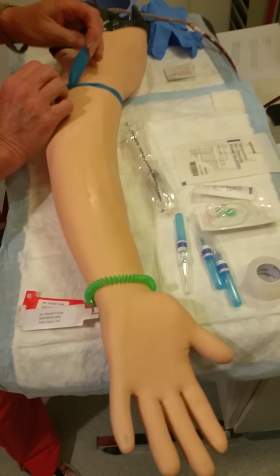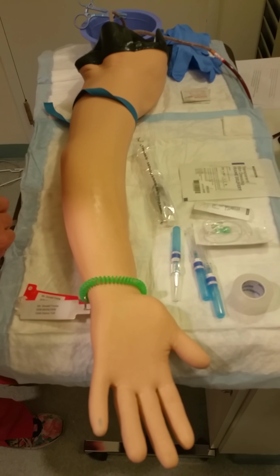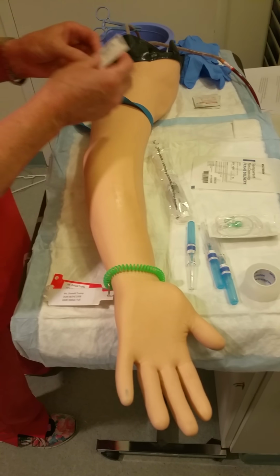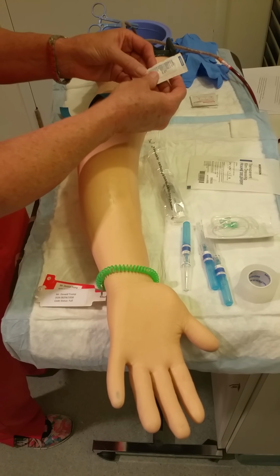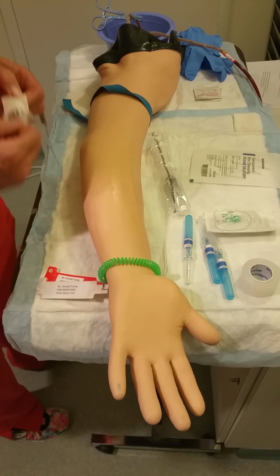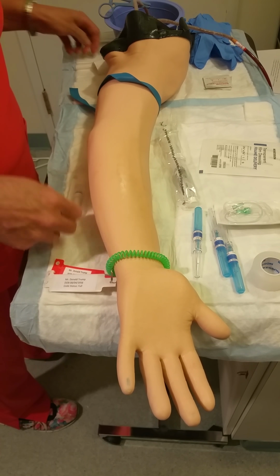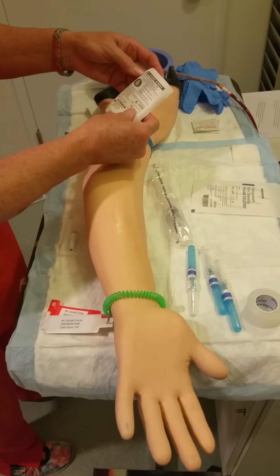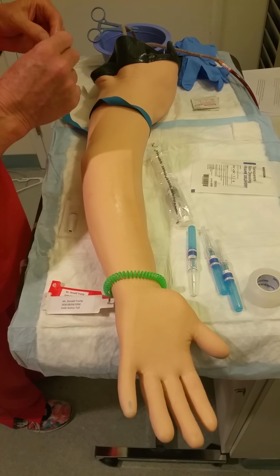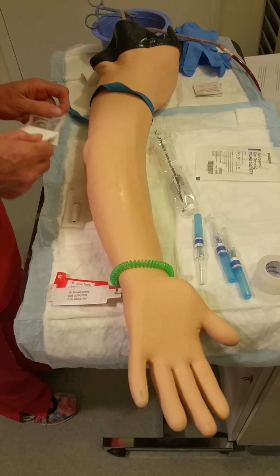I'll loosen the tourniquet for my patient's comfort while I assemble my saline lock. The components of the saline lock are the ultrasite injection valve, the luer fitting, and my extension set. It also has male and female luer attachments, which is what we use for a needleless infusion.